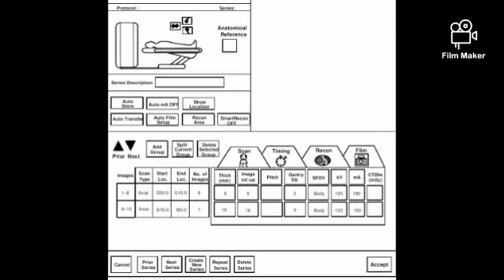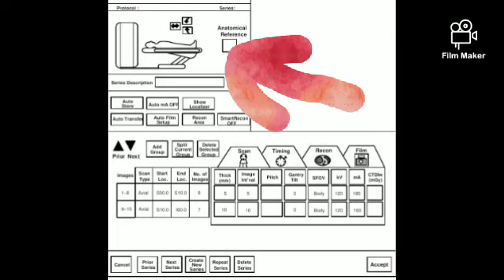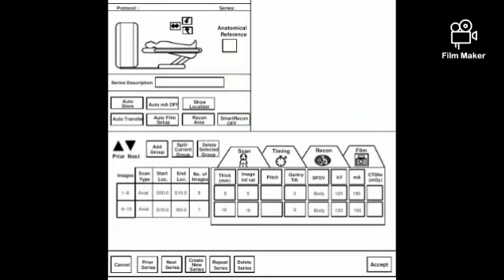and you can move to the main control panel. So you can see at the top, this is the gantry direction. You can select whether it is head in, out, head first, foot first. You can select what protocols you need, like scan protocol, timing, recon, and if you need a filming protocol. So all these things are available in our host computer.